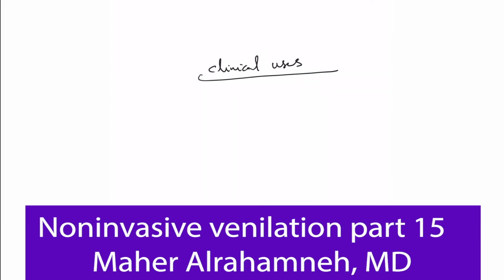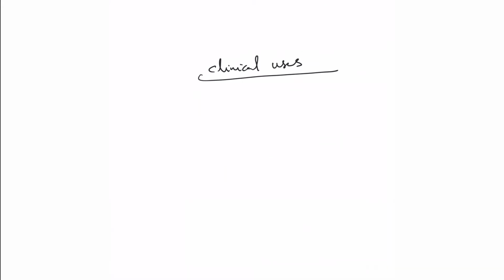Welcome back. Clinical uses of non-invasive positive pressure ventilation. In inpatient settings, in the acute situation, on the floor or emergency room, acute pulmonary edema. So if you're having a patient with acute pulmonary edema, use CPAP. And of course, this patient is hypoxic, so I would recommend you use 100% FiO2 and 15 centimeters H2O to start with and treat the underlying condition.